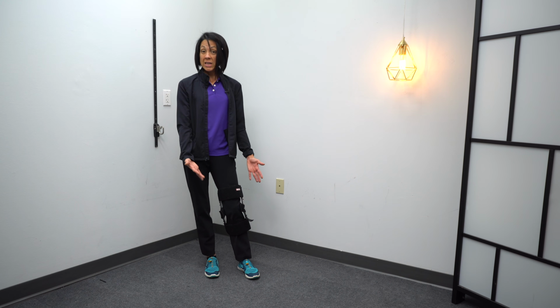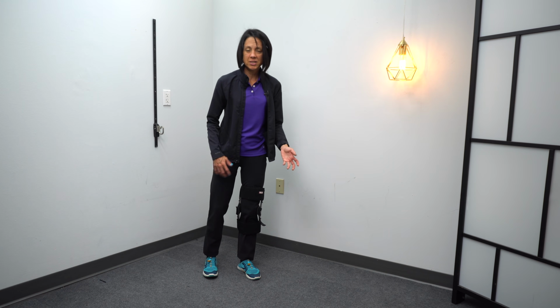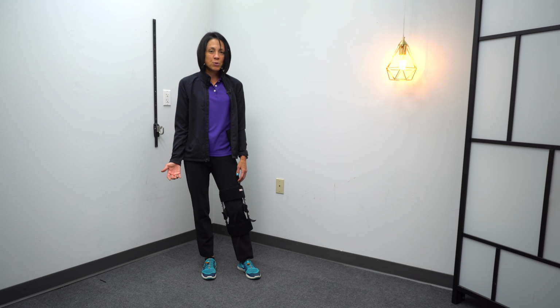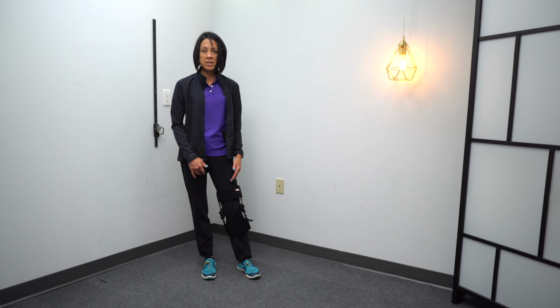However, I know some of you are really opposed to bracing, or even with your AFO on, your knee still hyperextends. That's when I would use a Swedish knee cage. The reason I would start with the AFO is because it's annoying. It's either going to go over your pants or under your pants. If it goes over your pants and you're going to the bathroom, pulling your pants down, things like that, it's not super ideal. And for a lot of people, because it's so bulky, it doesn't fit underneath your pants.